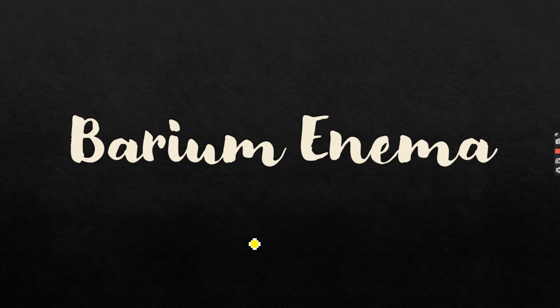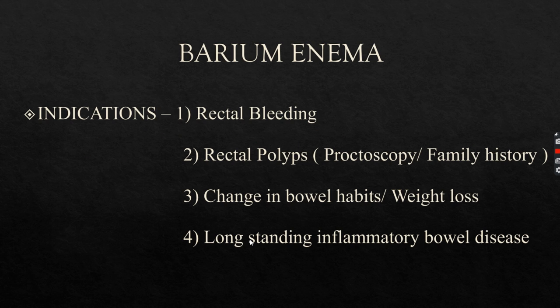Now finally, if we are suspecting any lesion in the large intestine, the option available is barium enema. The indications for barium enema, this is the last spectrum of the barium studies used in the gastrointestinal tract. If the patient is suffering from rectal bleeding or rectal polyps discovered on proctoscopy, or if the patient is giving a family history of rectal polyps, recent change in bowel habits, or recent significant weight loss, and if there is long-standing inflammatory bowel disease. So these are the indications for barium enema. Barium enema means, in this case, barium contrast is being given through the anal opening using a tube, right?